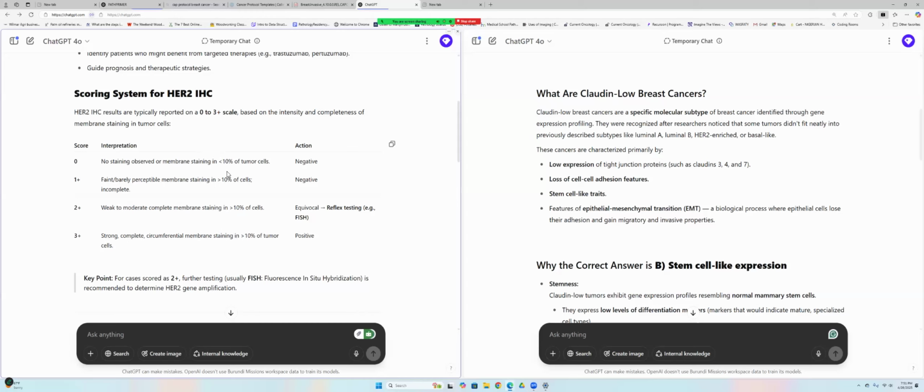Okay, let me look at it again. You look at it quickly. We'll look at it again. Negative, no staining, so it's 0%. It's a very complete staining. Okay. Let's look at picture examples.